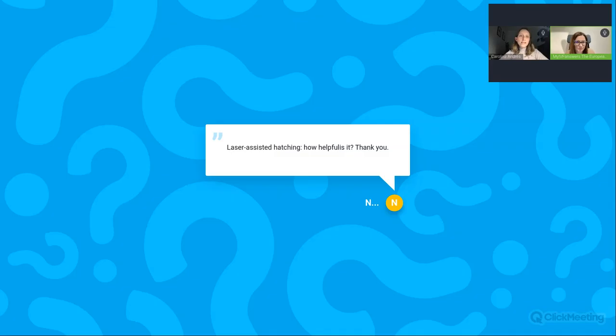Is it helpful? Yes. Assisted hatching for PGT is helpful because it helps us access the embryo better to perform the biopsy. But performing assisted hatching just to optimize implantation is not very well demonstrated.